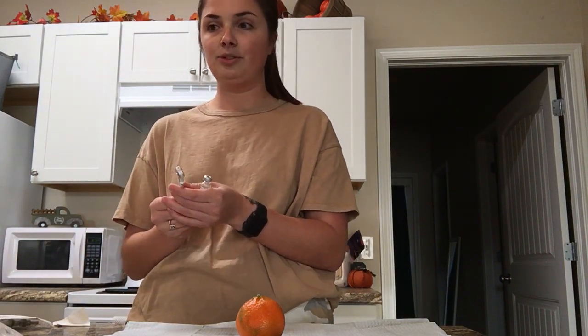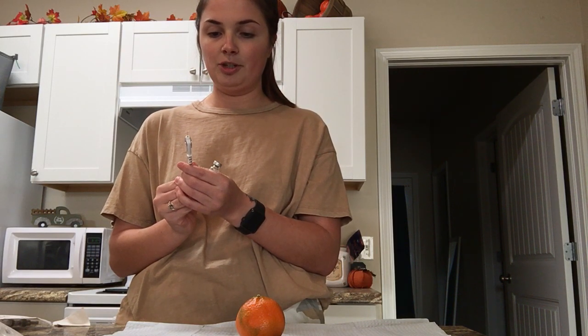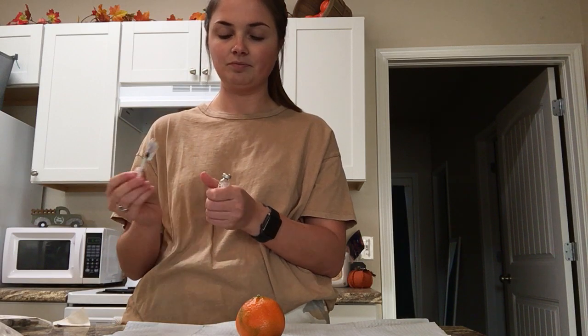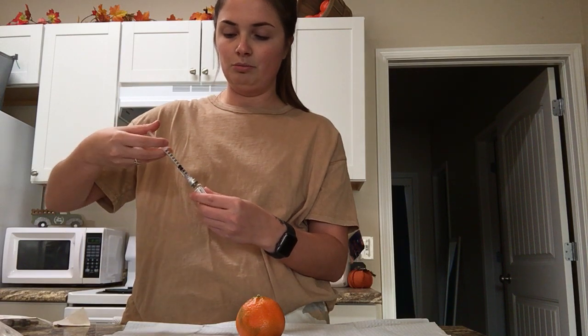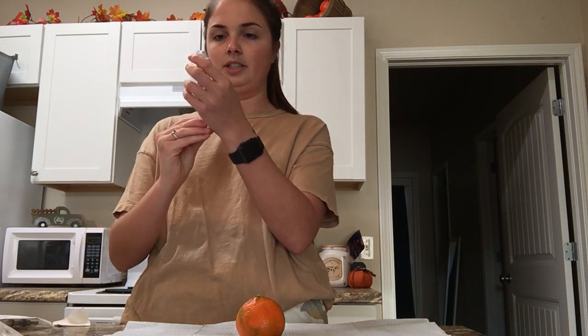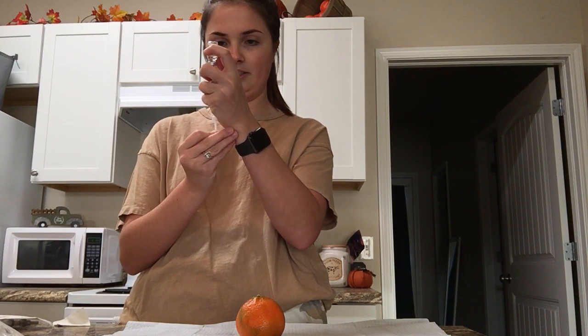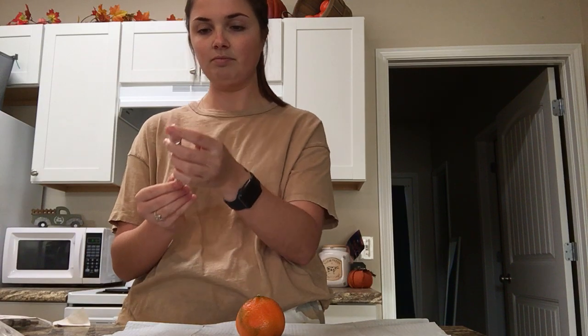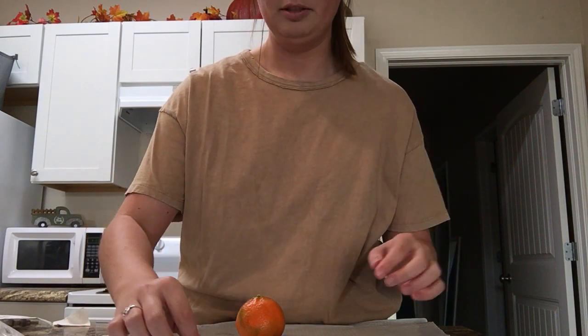So the MAR states that we need 3 units of insulin. So I'm going to draw 3 units of air, stick it into the vial, blow it out, tip this upside down, and draw 3 units of insulin. So I'm going to put the lid back on here just for a little bit. And then I'm going to get my patient ready.